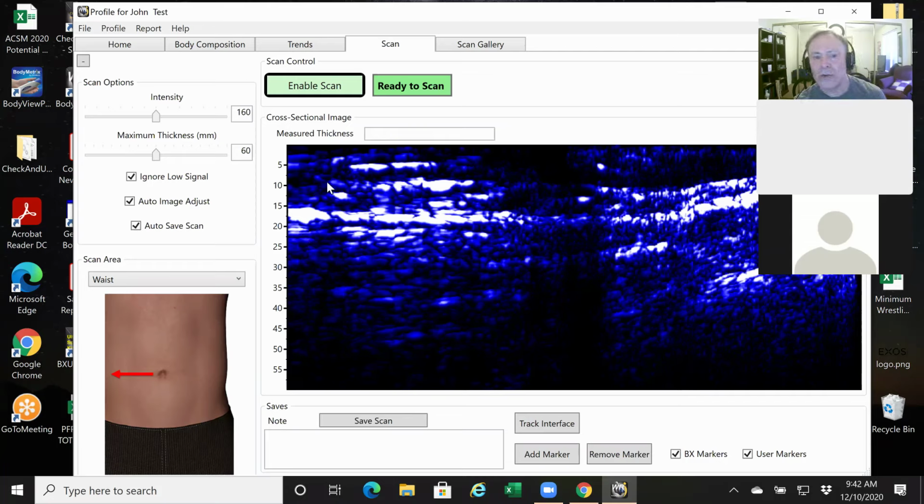It's a cross-sectional image. So in terms of interpreting fat thickness with the image, my focus is right here on the very left-hand side. Why? We're starting that image at our sight point, and as soon as I press that button, we're really at the site point as the image renders right here, okay?